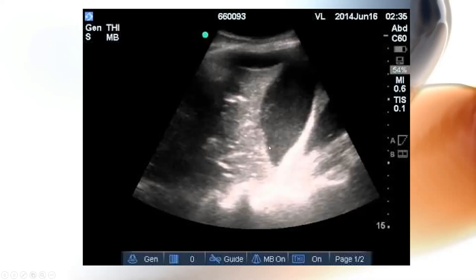So when you guys see this wedge looking thing, like maybe there, I don't know, because I think the whole image is too loud. So unfortunately, since I neglected to speak about it, I feel really bad, but just be very careful. One of the learner's mistakes when they're first learning is to turn the volume up. Just try to make everything brighter so you can see, and it's not necessarily super helpful. So you can give me bad feedback about forgetting to teach you about gain. So I don't know. The answer to this one could be simple, could be complicated. I would turn the gain back down to make sure my whites are not too white. And that is just something you'll learn over time the more you scan.